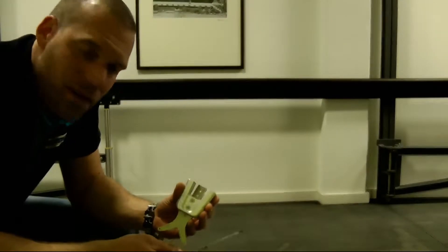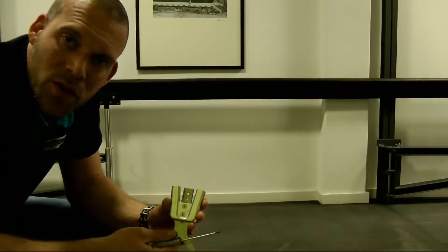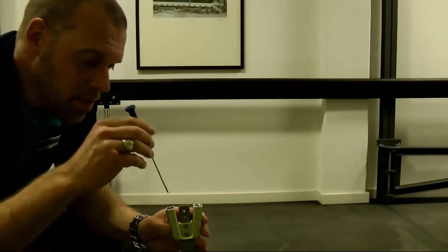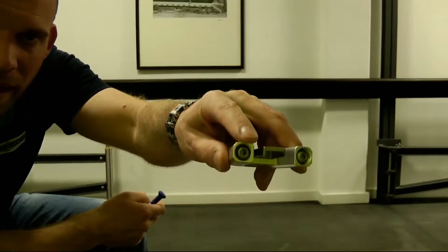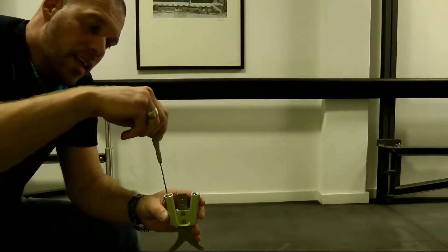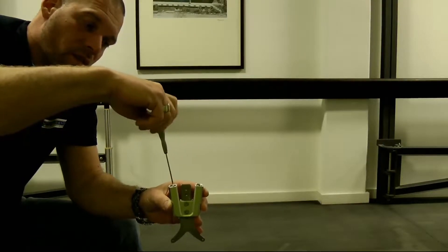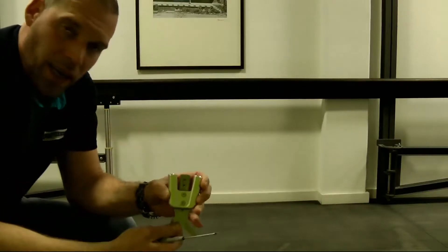We should look at that and additionally, to check the functionality, we should make sure that the movement limitation screw — which you can see here when you look through the top of the hex screw — there is a slotted screw, and this screw should be turned all the way out, meaning it turns upwards as much as possible, to achieve the full range of motion of the spring unit.